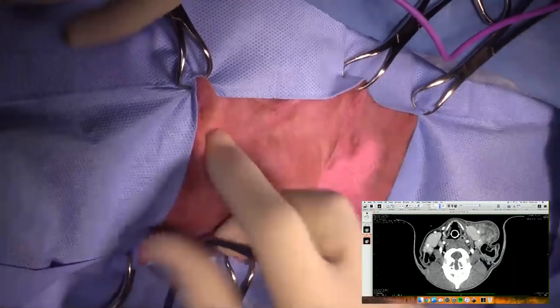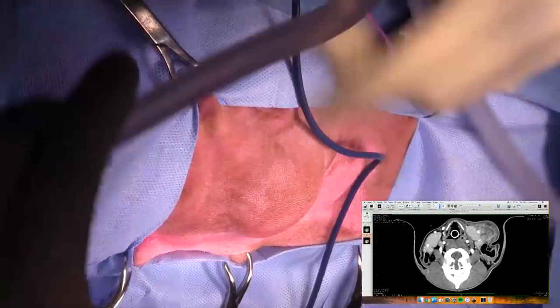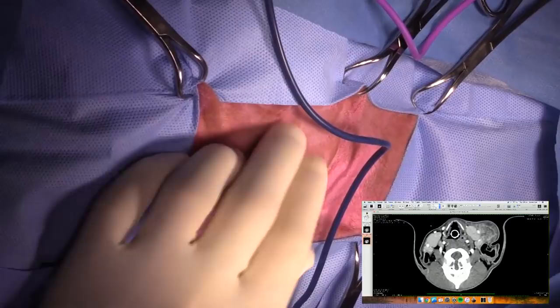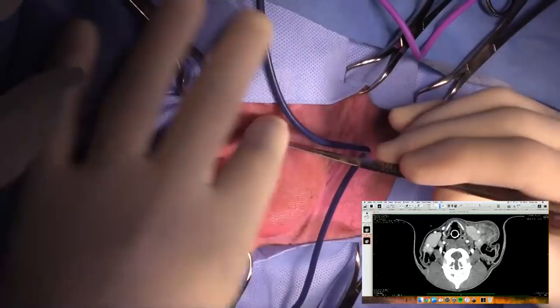Thanks, Jess. And we'll be using suction because we may have some pus that makes an appearance in the wound. Might get a Yankauer suction tip, please. All right, so the skin is kind of indurated. The skin is nice and thin outside of the abscess, and then when you get over the abscess, it's indurated. So I've got lots of extra skin in this area, so I think that I'm just going to excise that skin en bloc.